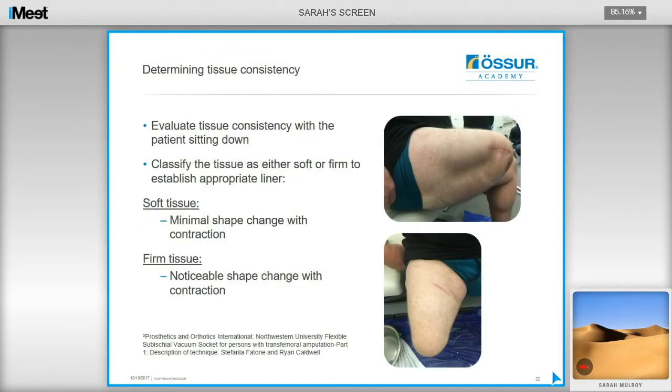To determine tissue consistency and choose the appropriate liner, evaluate the user's residual limb with the patient sitting down. Soft tissue is classified as minimal shape change with contraction, and firm tissue shows a noticeable shape change with contraction. With experience, if someone has a mixture of firm and soft tissue, the Relax 3C is recommended as it will help contain that soft tissue, whereas if they have firm tissue, stick with the Synergy liner.